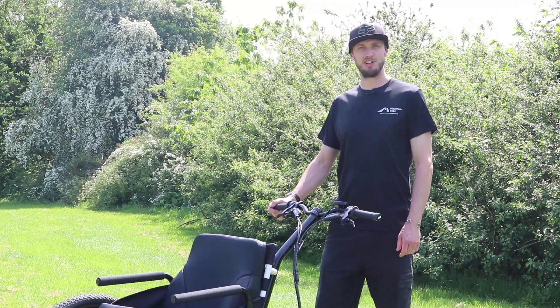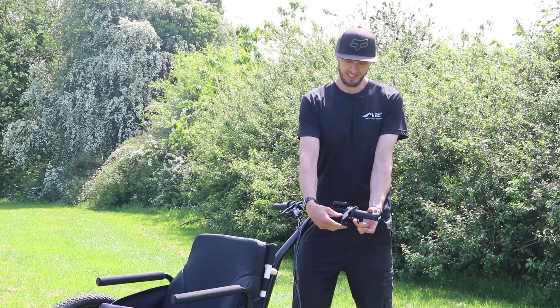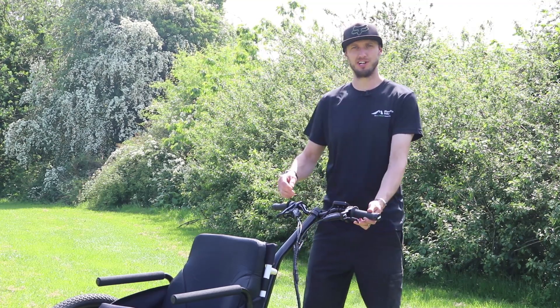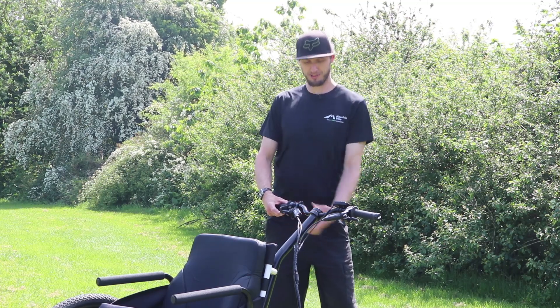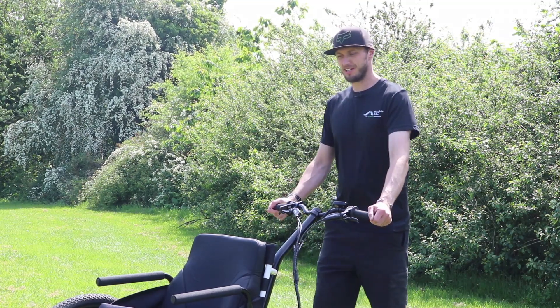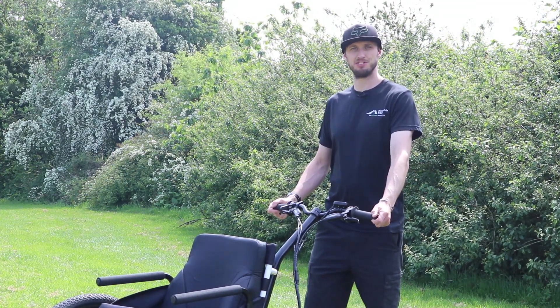The brakes can be locked on using the parking brakes. Simply pull the brake lever and push the parking brake up and that locks it on. Same on this side — pull the brake lever and push the parking brake up. Now the trike is locked solidly so it's nice and stable when getting in and out of the trike.